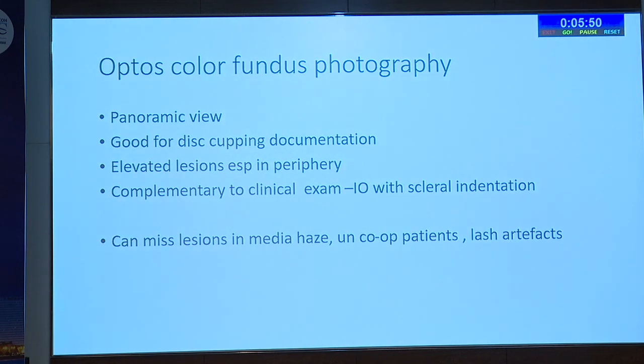It is also good for disc cupping documentation. With standard fundus photography, you have bleaching of the disc, whereas with the Optos, you don't have any bleaching of the disc. You can have excellent cup to disc ratios, and undilated, it is extremely good. Then elevated lesions in the periphery, as I said.